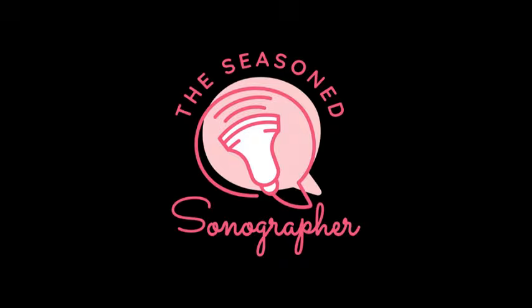The placenta location. Where is it? Is it anterior? Is it posterior? Is it fundal? Is there a previa? If you suspect a previa, you'll measure, and if it's less than 2 centimeters from the internal os, that is a marginal previa or a low-lying placenta. And then a complete previa is obviously covering the internal os of the cervix.